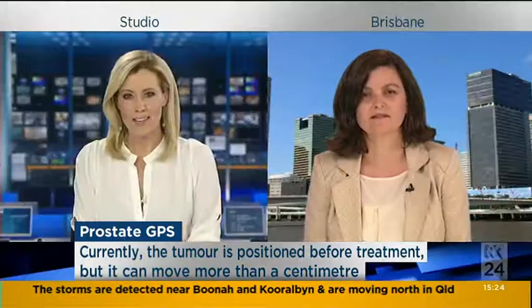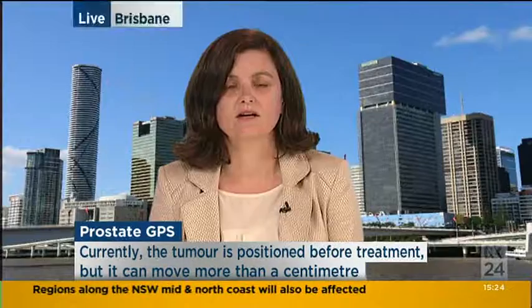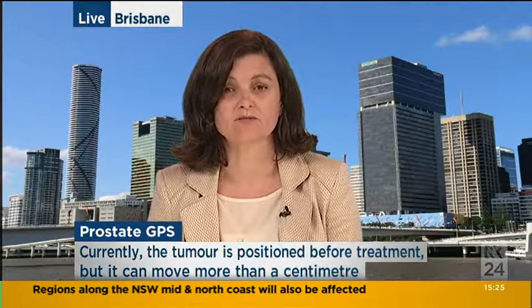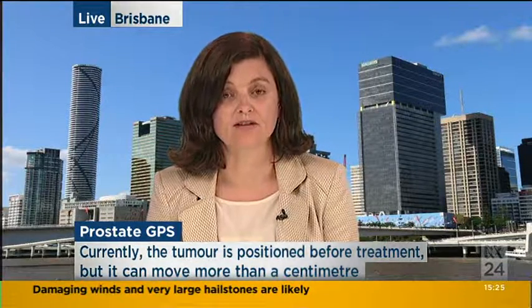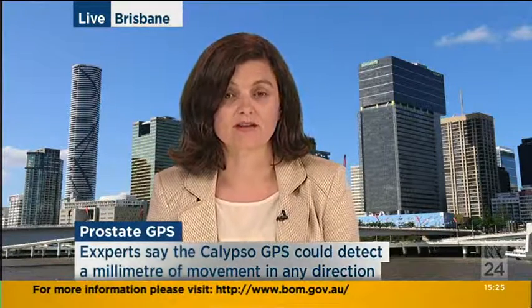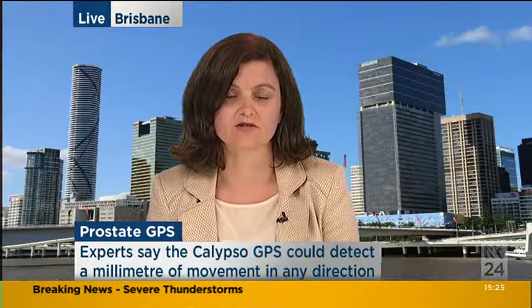And given that using the technology associated with the Calypso is more targeted, does it mean that you can increase the dosage of the radiation? So we wouldn't increase the dosage. It's certainly about accuracy, but it's more about reducing the side effects. But what we are trending towards worldwide with prostate cancer is using fewer fractions and bigger treatment doses, and in doing so potentially increasing dose for patients in that setting. And when we're doing that, Calypso becomes very useful because of that increased accuracy and decreased dose to the tissues around the prostate.